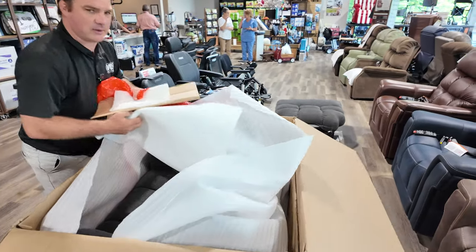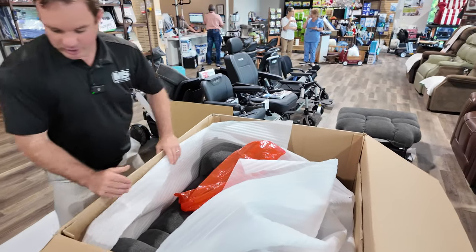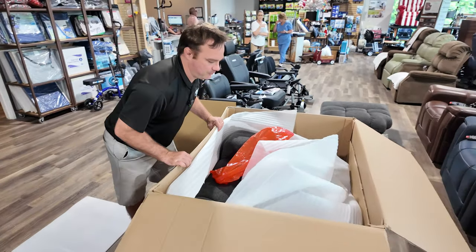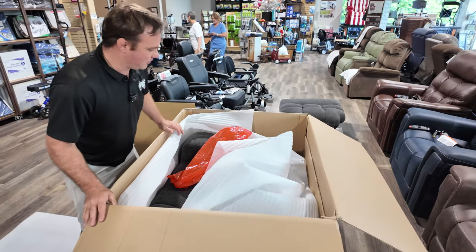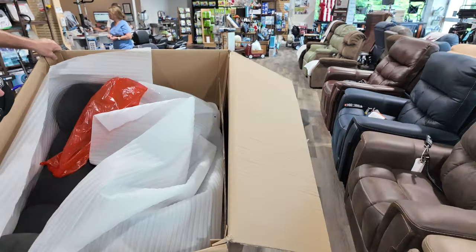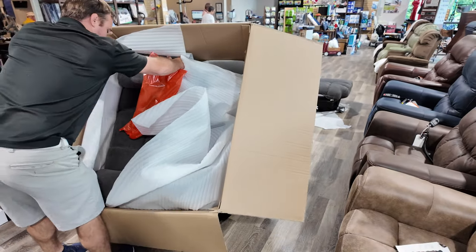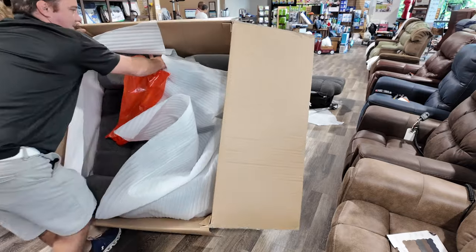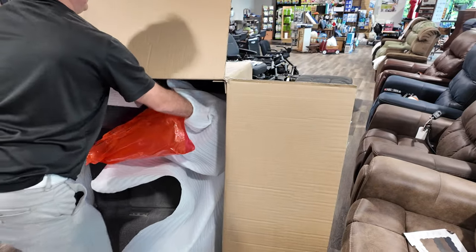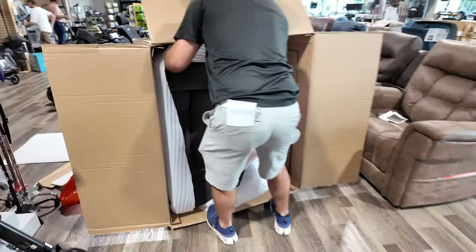That's what I was trying to get out — it's denim! So you could cut the box down, you could possibly cut the bottom, or you can put it on its side and slide it out. The hardest part is going to be getting it out of the box, especially if you're doing it by yourself like I am.